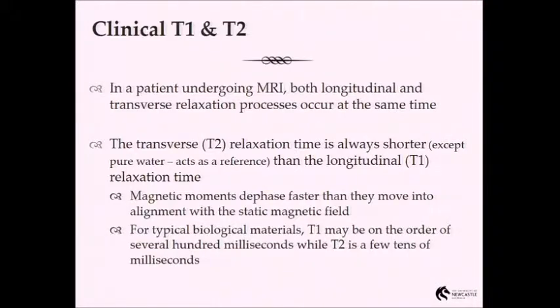So I mentioned yesterday that this idea of NMR has been around since about the 1940s, and then this guy Damadian measured T1 and T2 relaxation time, so just the pure time in tumour tissue compared to normal tissue, and noticed that there was a difference, mostly more prominent in T2, between normal tissues and tumour tissues. And this is what really got people thinking, so if we can measure that in tissue, how do we do that in humans? And that was really what made people start to think MR is a thing that we can develop as a medical imaging tool.